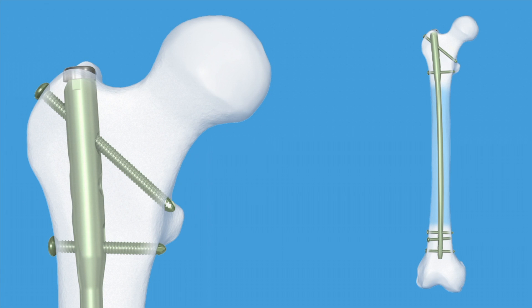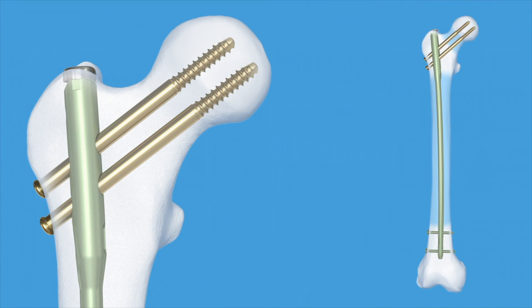Recon locking is used when there is a combination of 32A, B, and C fractures with 31B type fractures, when the 32A, B, or C fracture site is close to the lesser trochanter, or especially with subtrochanteric fractures. In this practical exercise, recon locking will be demonstrated.